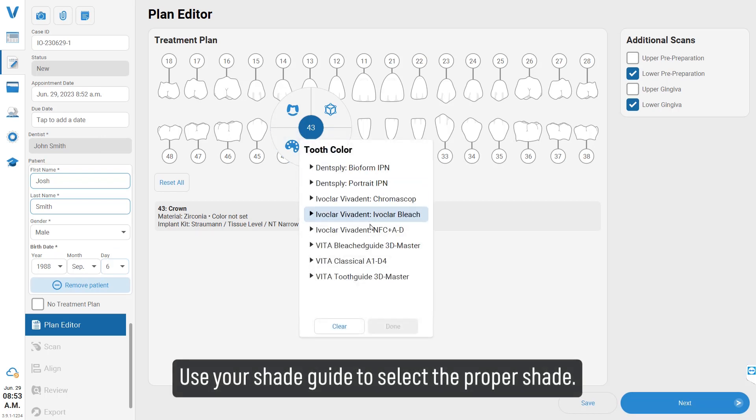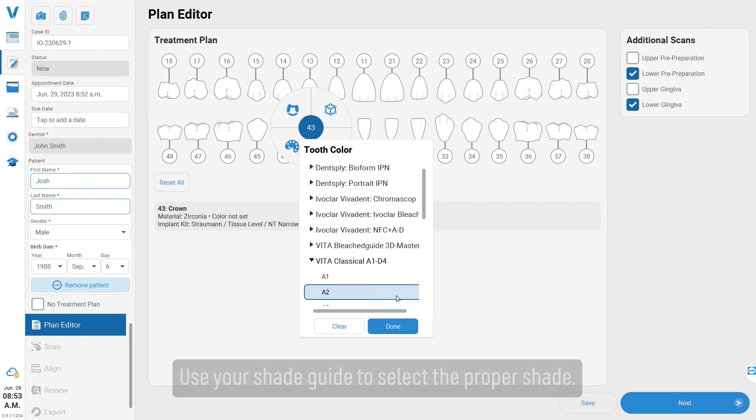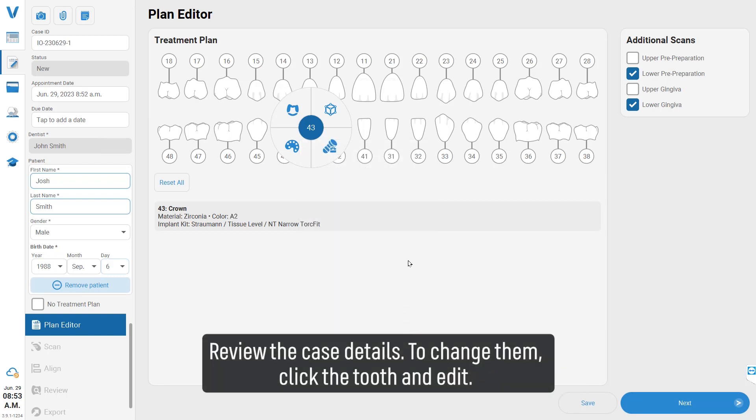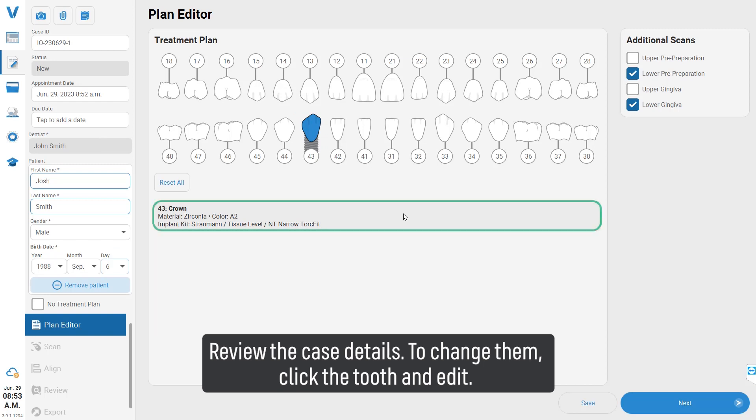Use your shade guide to select the proper shade. Review the case details; to change them, click the tooth and edit.